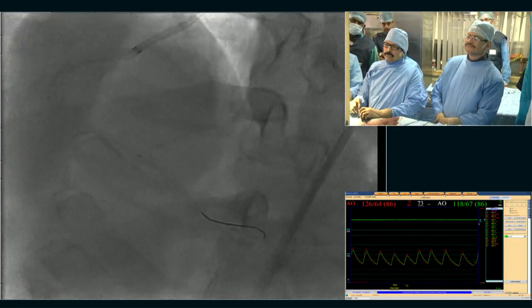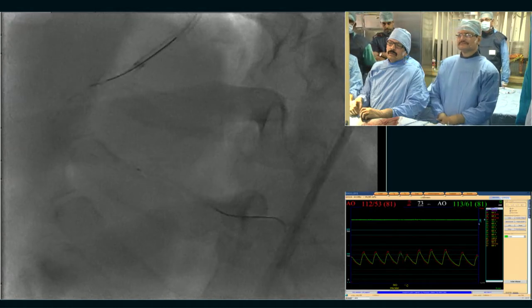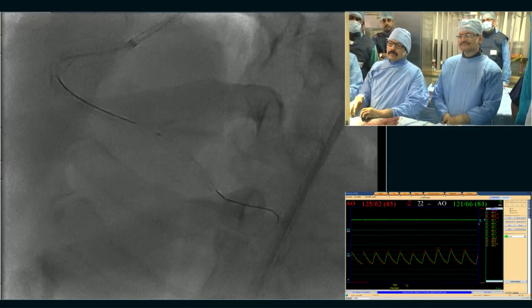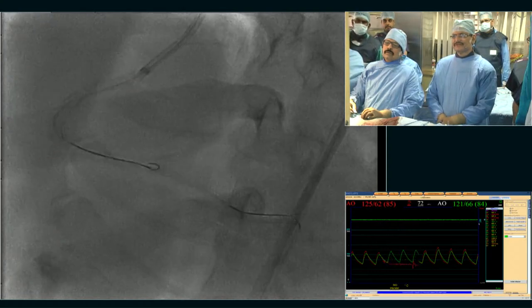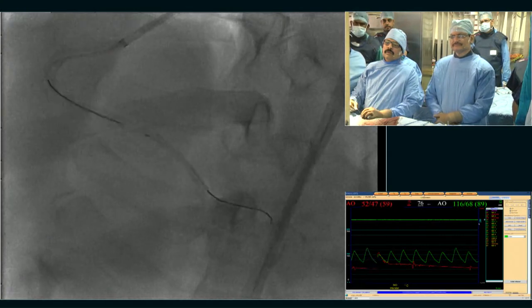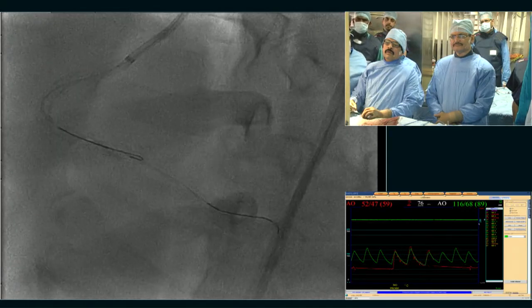They cannot penetrate the ostium of the posterolateral branch. Another point is because the main branch is a stent, we can also use a marker, because sometimes the angulation with the double lumen can be difficult to manage to place the wire in a side branch.